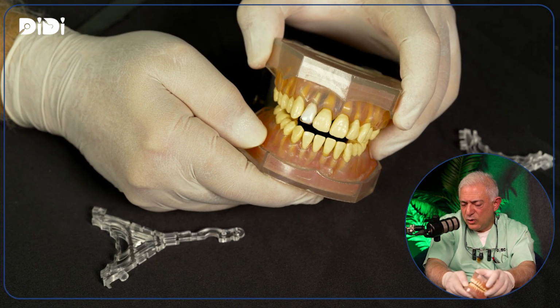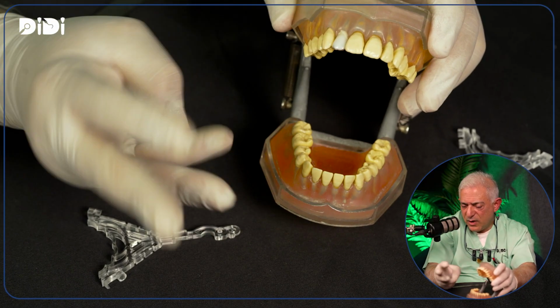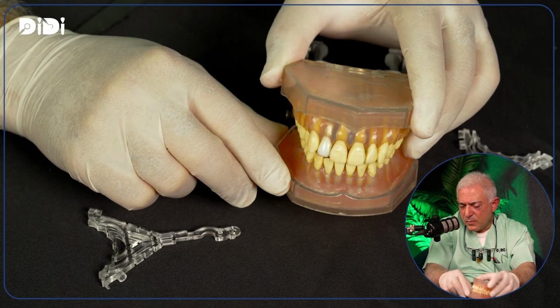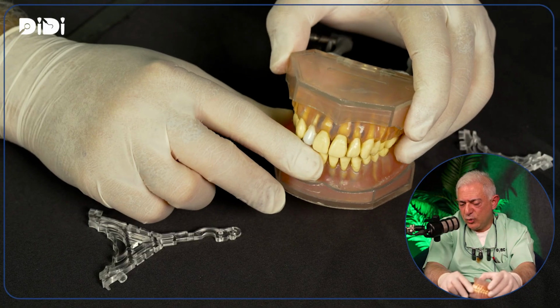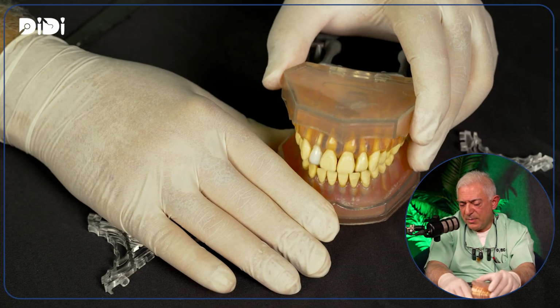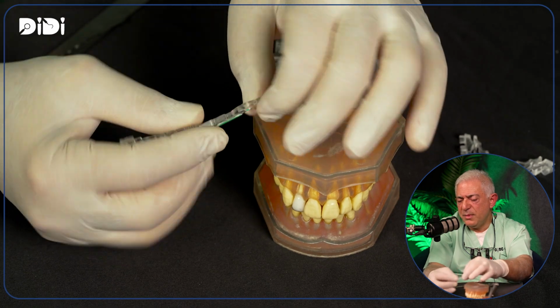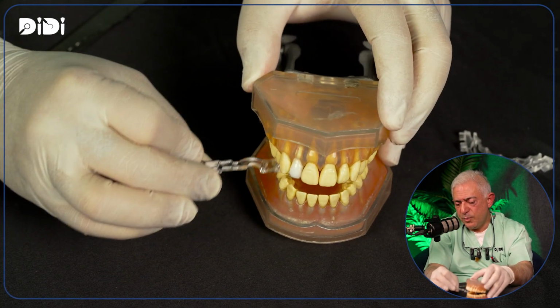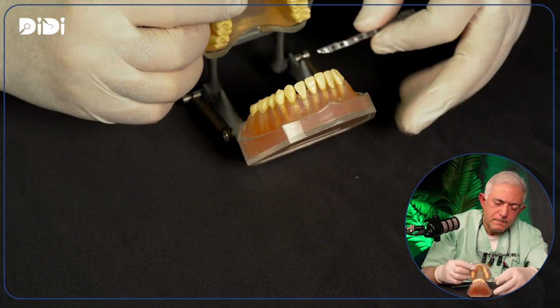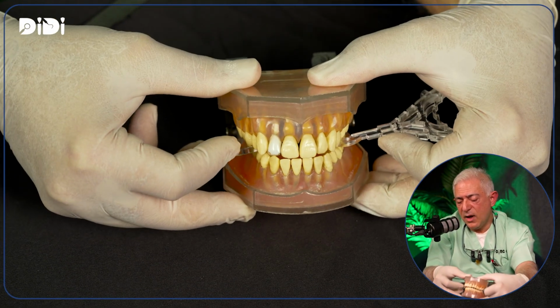You got exactly what you want because the thickness that you want is 1.5, and that's the ideal thickness for either zirconia or Emax. So in the posterior area it will be less, and in the anterior it will be slightly more, but that's within the limits of the ideal thickness for ceramic materials. Now you might say, I want to do both arches. Then you go to the 3 millimeter, which is this width. So you place one here and the other here, and you ask the patient to bite. And once the patient bites, then you have 3 millimeter open.